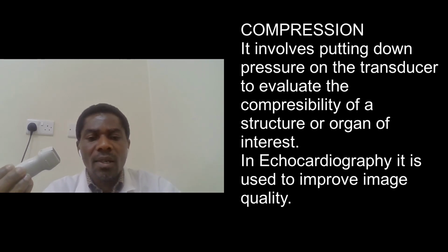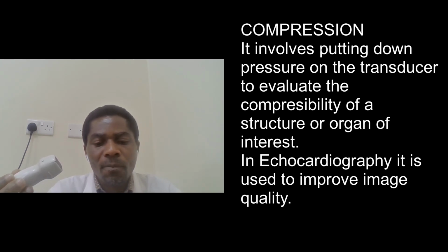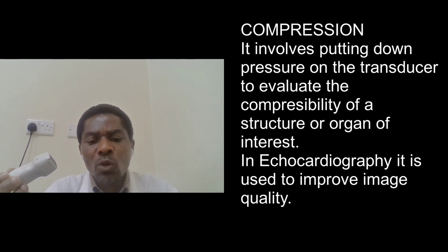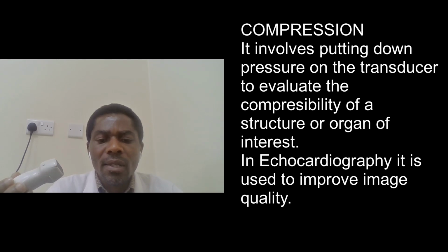Lastly, let us discuss compression. Compression involves putting down pressure on the transducer to evaluate the compressibility of a structure or organ of interest. Compression is commonly used when evaluating deep vein thrombosis (DVT).